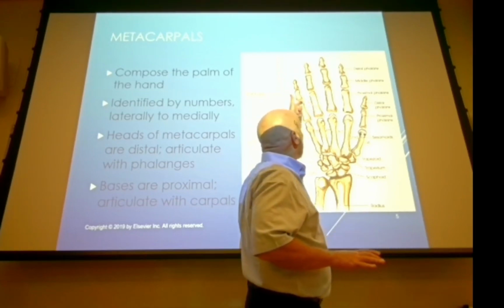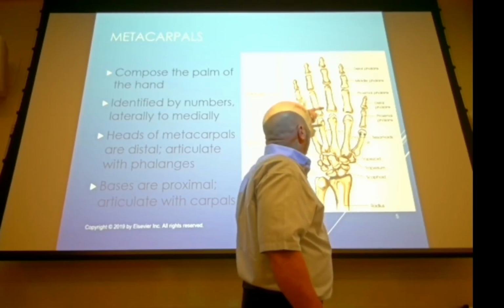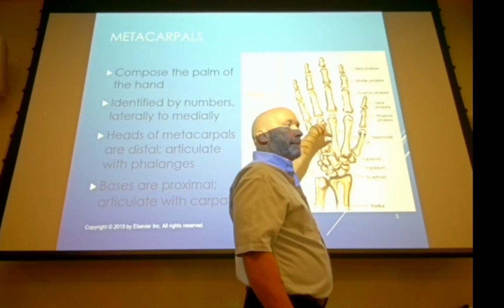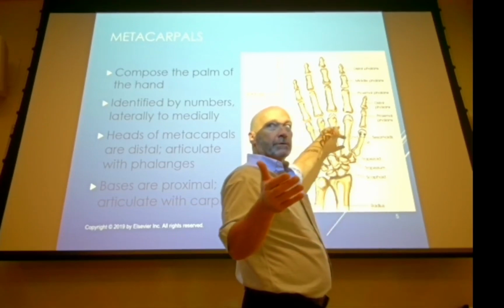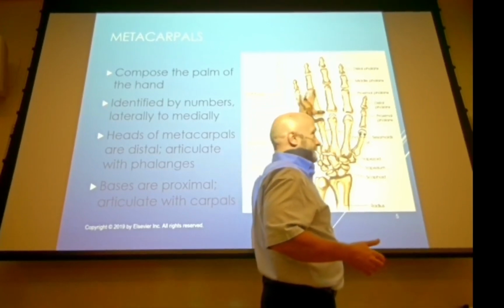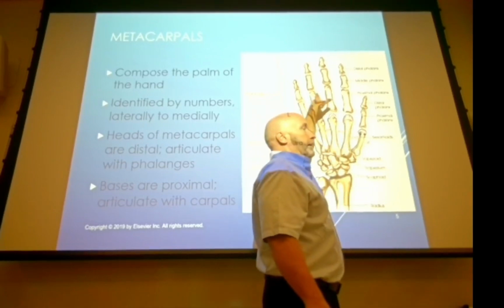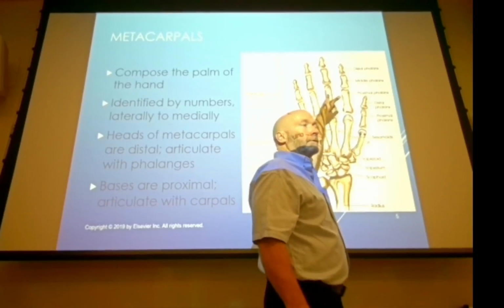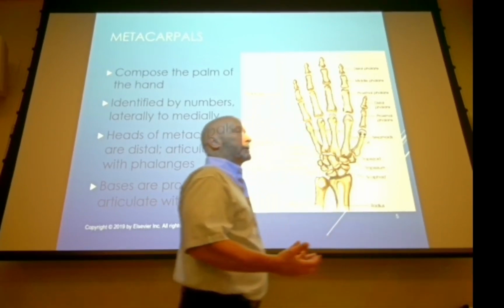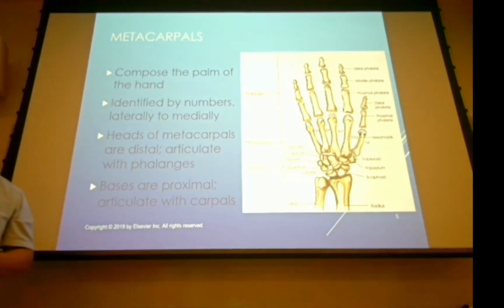That would be the proximal, so that would be the distal, right? So again, we've got the 4th. What is this here? Metacarpophalangeal joint. That's metacarpal, that's a phalanx. It's a metacarpophalangeal joint. That would be the proximal interphalangeal joint. Right. Now, where do you center your central ray for a hand?